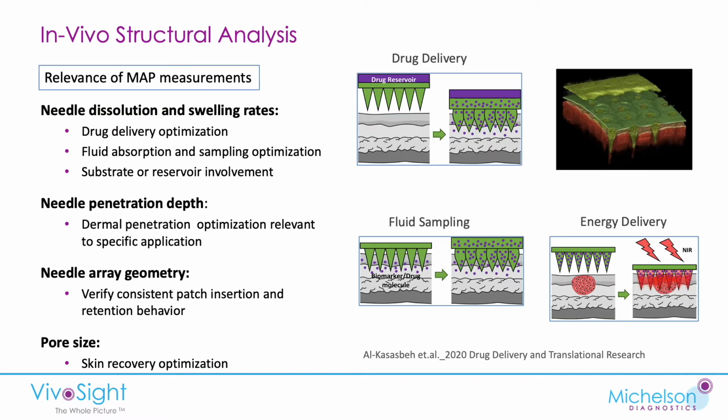And this is really, really important for microneedle characterization and for optimizing the design. How well do the needles penetrate? Do they penetrate to the right level? Do they deliver the drug in the way that's been designed or anticipated? And after removal, we can also look at the skin recovery. These are all key parameters for microneedle design that OCT imaging gives you a key insight into.